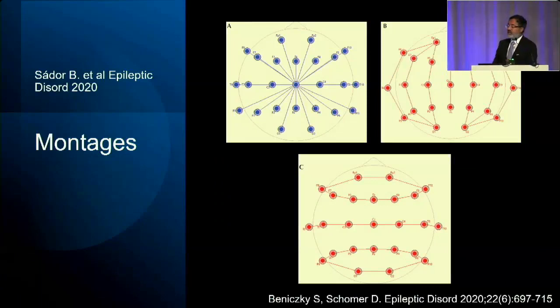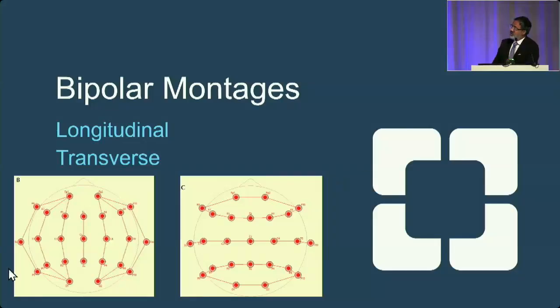In a bipolar montage, you can go longitudinally, such as this situation, where you take the first channel, representative of FP1 in comparison to F7. It's a mathematical subtraction. So you take information of what's seen in FP1, subtract it from what is seen in the second electrode, F7, and that gives you the result. The amplifier amplifies the activity so you can see it better, but that's simply how the EEG has been displayed. So bipolar montages are comparing adjacent electrodes.